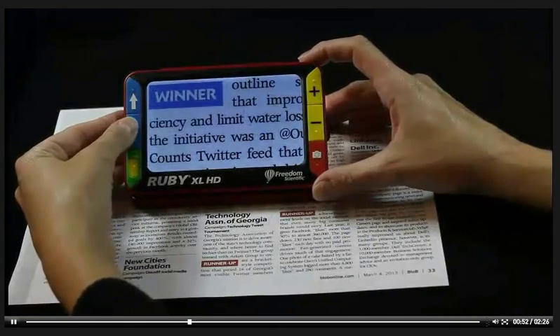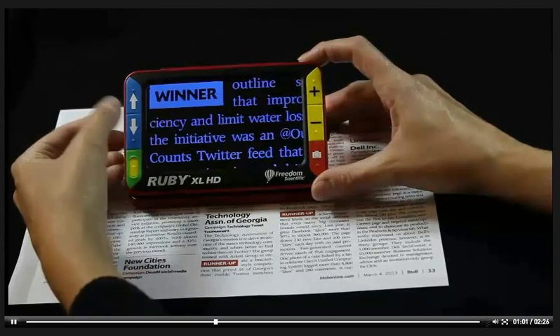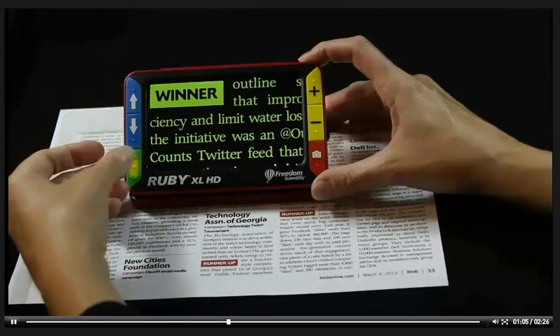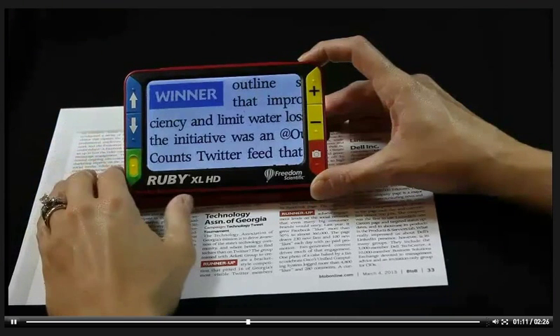Ruby XL HD comes configured with full color and 4 high contrast text reading modes. And you can easily add more, up to 20. You can move through them forward and back with the up and down arrow buttons. To go directly to full color or to your last used high contrast color mode, just hold down the power button and press the down arrow.